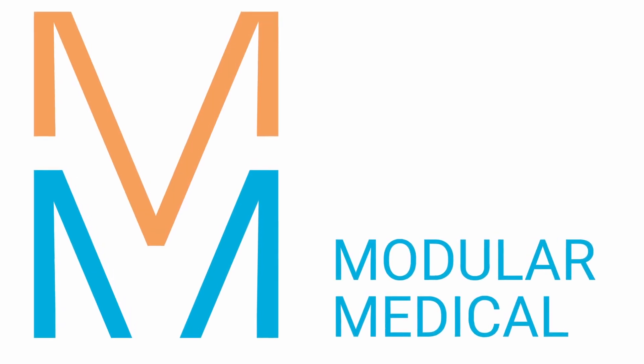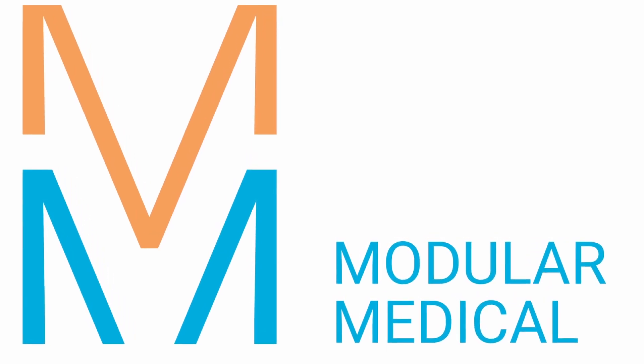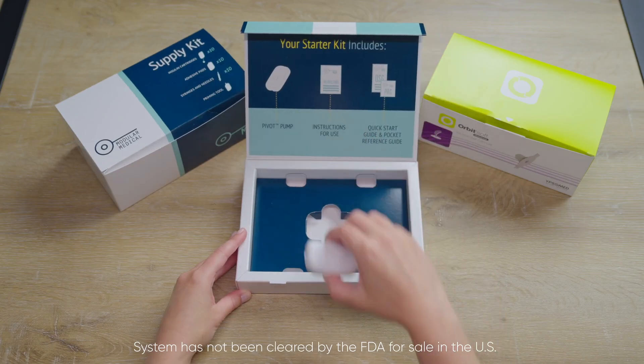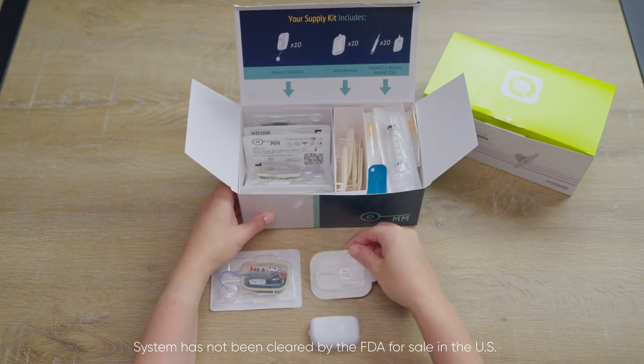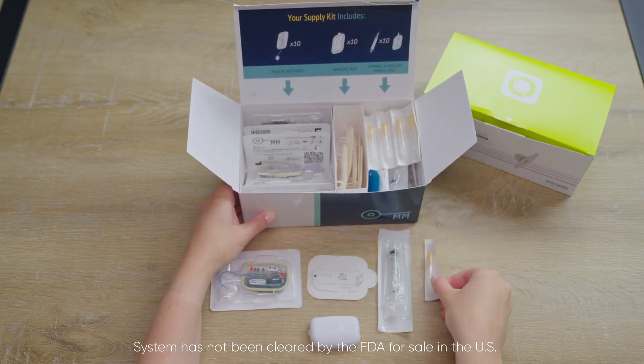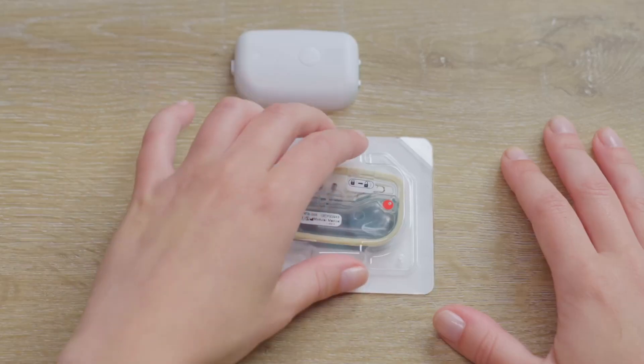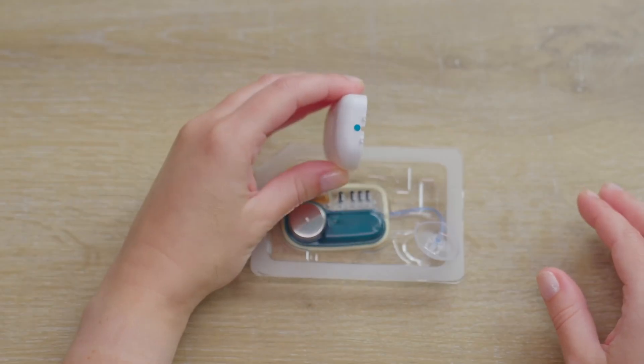Modular Medical's Mod1 insulin infusion pump system has been designed to support improved therapy with minimal user engagement. A supply kit contains the consumable cartridge reservoirs and all consumable components for setup. The cartridge reservoir contains the battery and simply snaps to the pump and powers on the system.